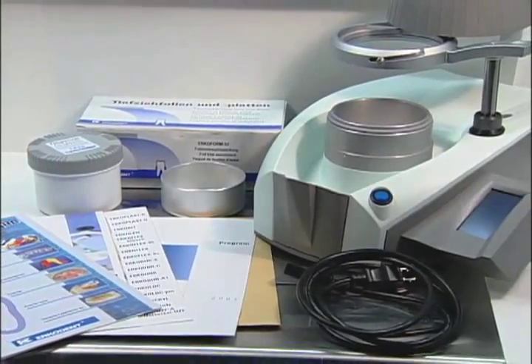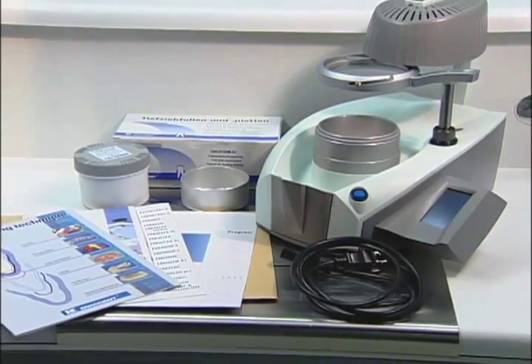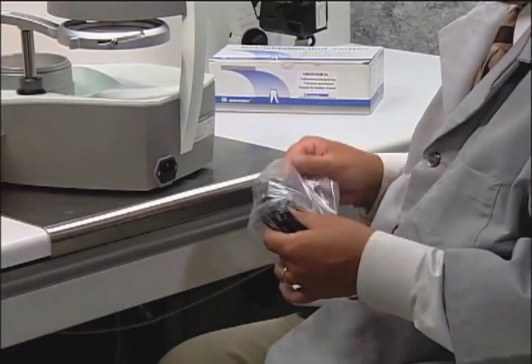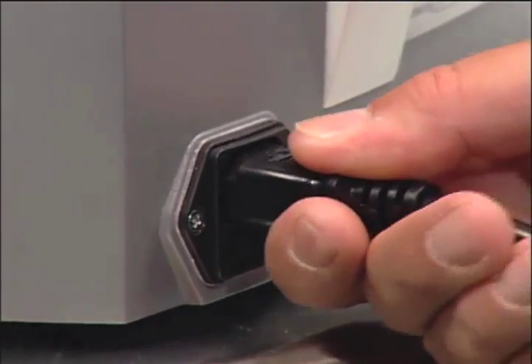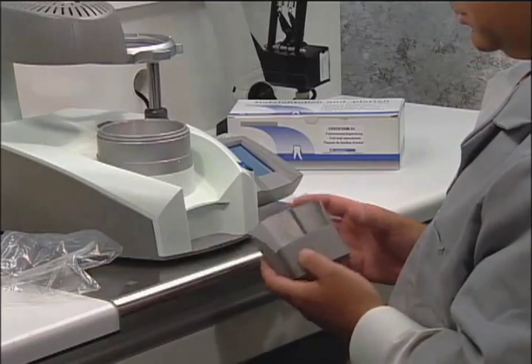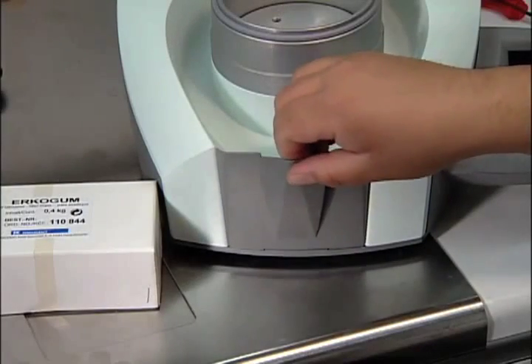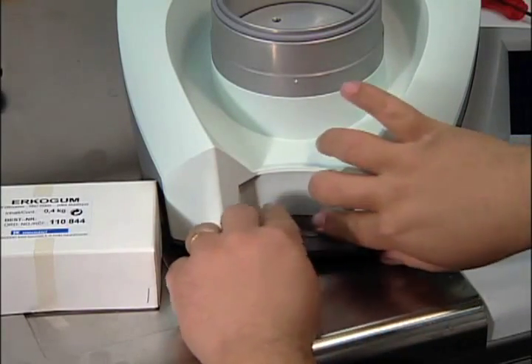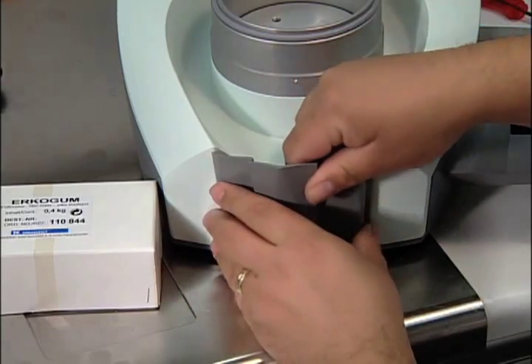You will find enclosed in your Erkoform packaging complete instructions and materials to thermoform all types of appliances. First, locate the electrical cord and plug it into the back of the unit. Place the granules collecting device in the front of the unit to catch any loose granules. If the collecting device is loose, add a small piece of Erkogum to the bottom of the device and place it back into the unit.